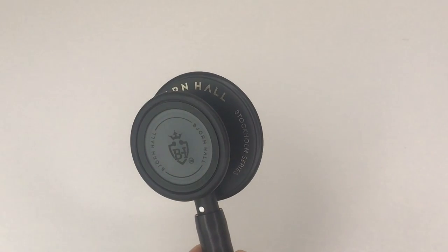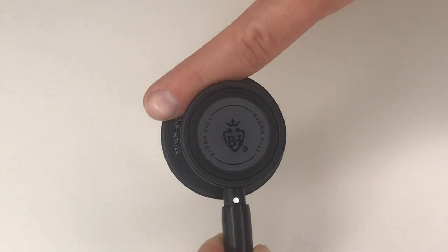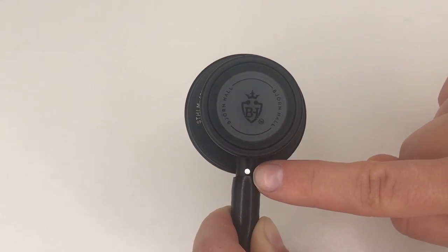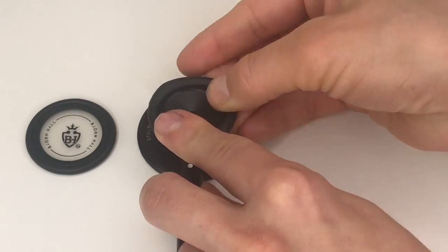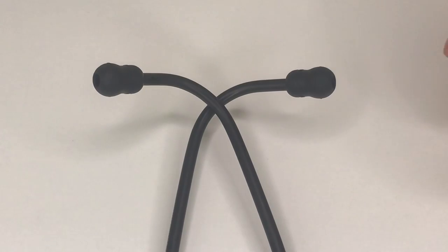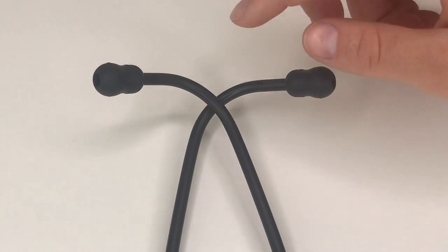I designed the stethoscope with my Scandinavian heritage in mind, with functionality and simplicity at the forefront. The chest piece is made of stainless steel and the finish is black and smooth. It is turnable and it has got a white dot indicator to let you know which side is active. The paediatric side can turn into an open bell if you wish to do so. The binaurals are adjustable — simply pull apart to make it looser or push together to make it tighter. The ear tips are nice and soft and round to create a great seal, and they come in three different sizes for different sized ear canals.